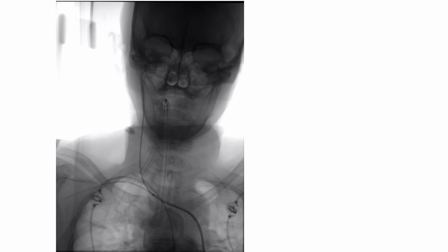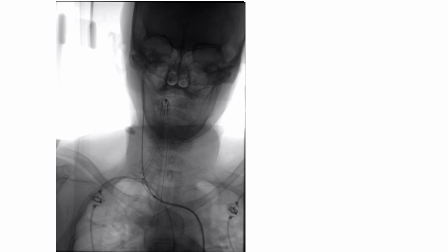Now I will replace that with an extra stiff wire. Pull out this wire. Once I pull this wire out, I'm going to push the long sheath up, and it is not a problem at all. I hope you understood this.